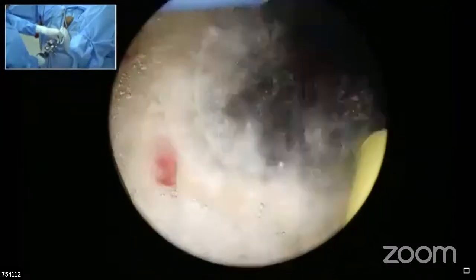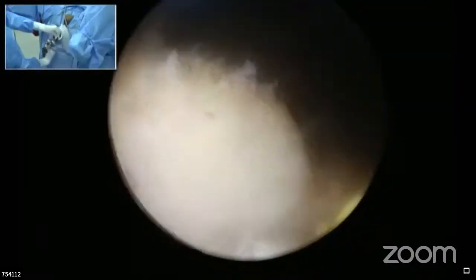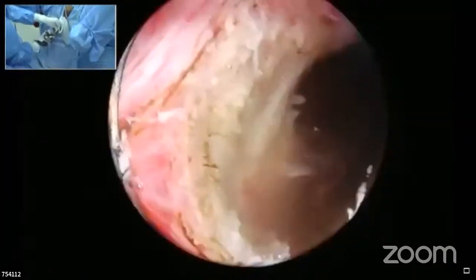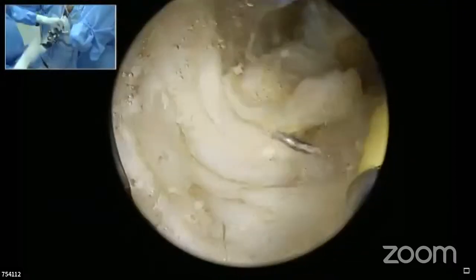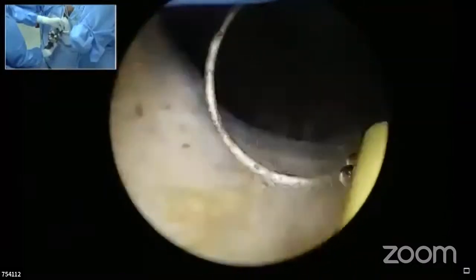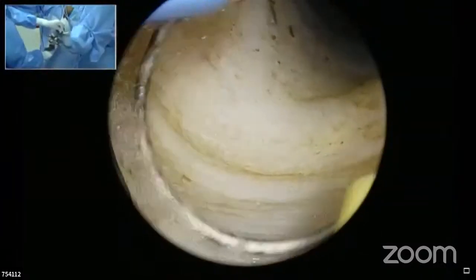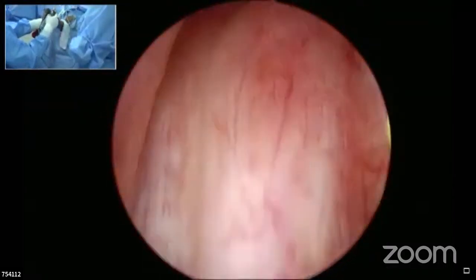Once we reach the capsule at 11 o'clock, our next option would be either we proceed and laterally debulk it, like was shown, we can increase and resect and make grooves layer by layer, or we can keep proceeding, making and enlarging the groove and slowly detaching the lobe from the capsule. Akin to what exactly we follow in most of the enucleation techniques. So we keep following and tracing the capsule and mobilize and devascularize as much of the gland as possible.